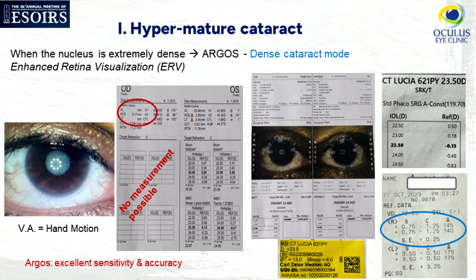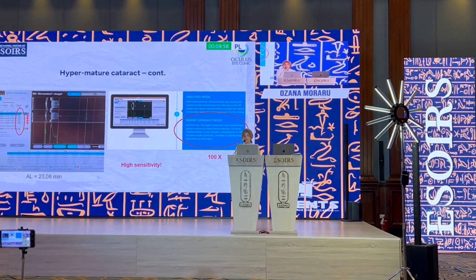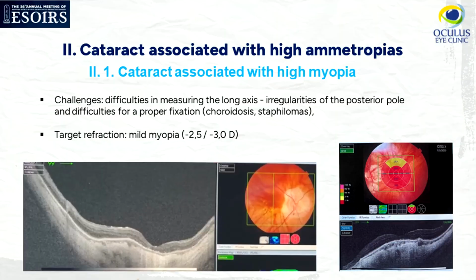So, an excellent sensitivity and accuracy as well. It used the dense cataract mode, as I just mentioned earlier. Let's say cataract associated with high myopia. We know in these patients there are some challenges regarding the measurements. The measurement of the anterior-posterior axis, because we can have choroidosis and the patient cannot fixate the target, or staphylomas with irregular fundus and so on.